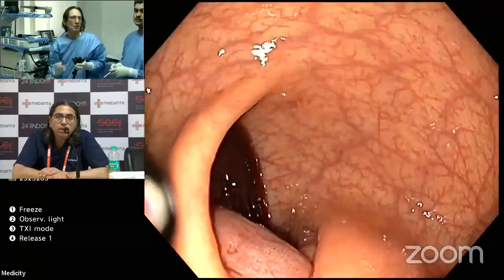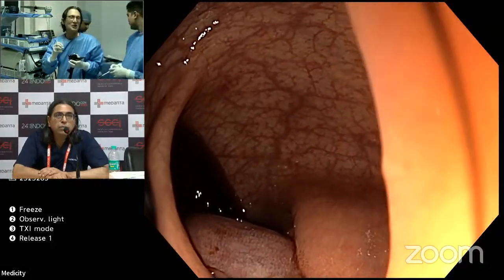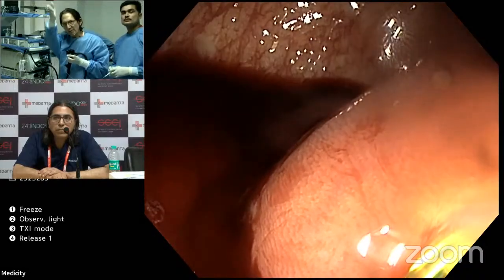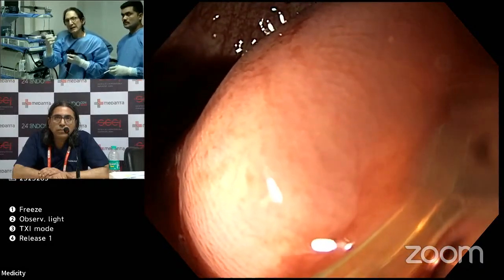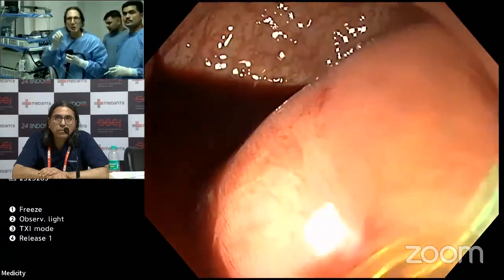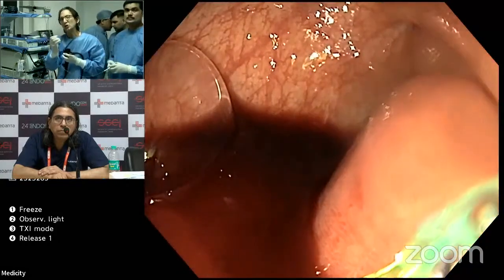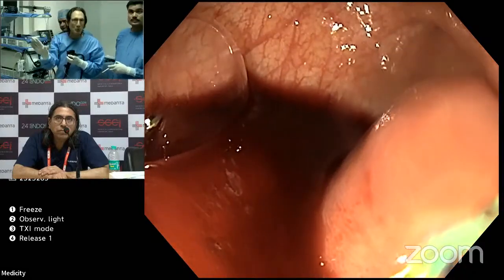And so now the discussion could be, do we need to actually resect this, or can we just let it slough off? So this is called loop and let go because we know it's a leiomyoma. Now, if it were a GIST lesion, I incise it in a cruciate manner, make 2 incisions, and then I just let it enucleate, because now you've opened up the mucosa like a flower, and then you let the lesion spontaneously enucleate on its own. And I do get biopsies with a large jumbo biopsy forceps so that we can calculate the mitotic index if it's a GIST. But what you've done is you've inverted the wall so that you're getting a full thickness ligation. So it's maybe in some ways a more clever way of treating this without any risk of perforation.